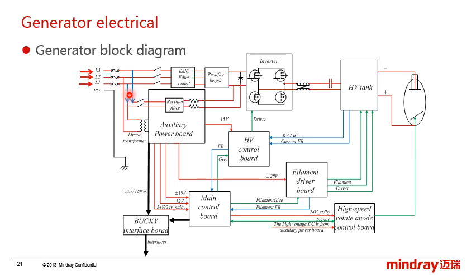The L1 and L3 lead to the charging circuit. This is the charging circuit to charge the bulk capacitor.